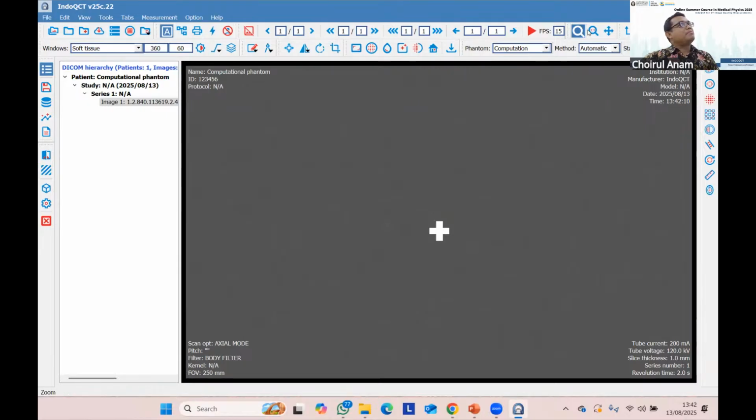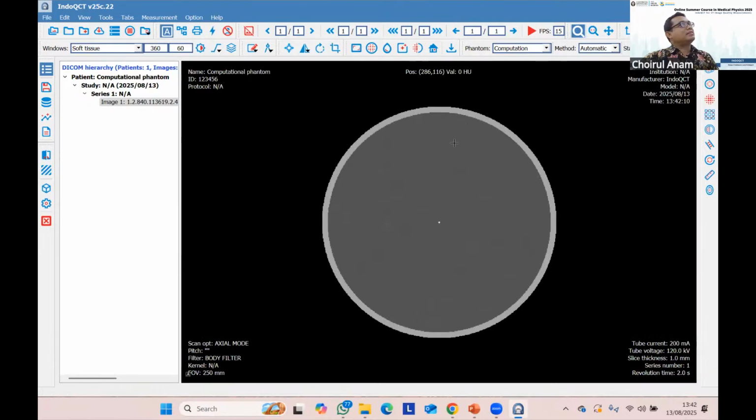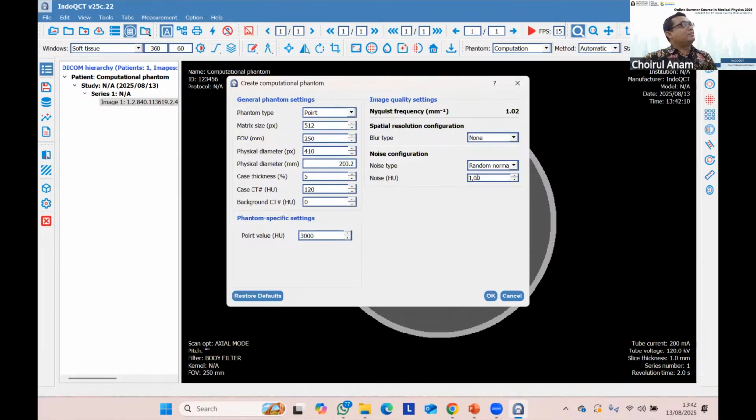Okay, we go back to the standard appearance, and in this occasion I will set the noise to none, or zero.